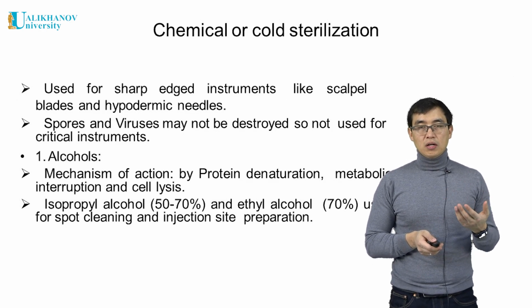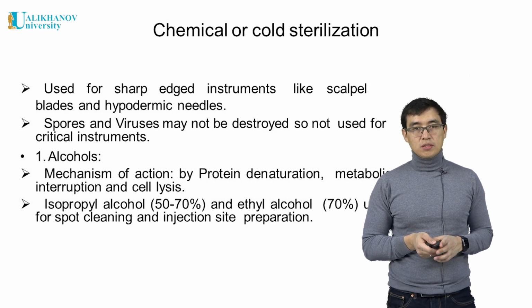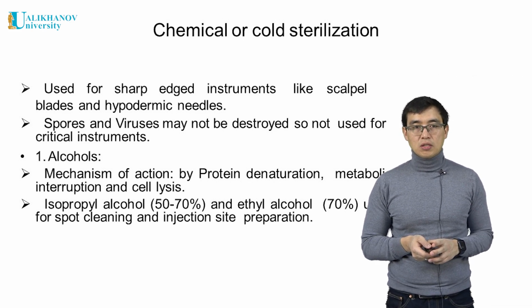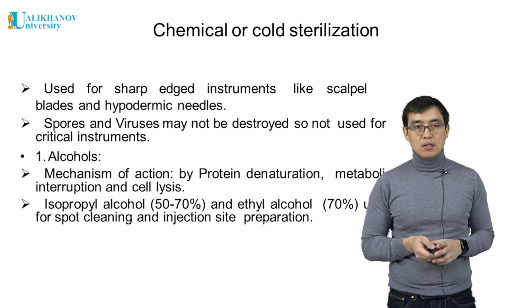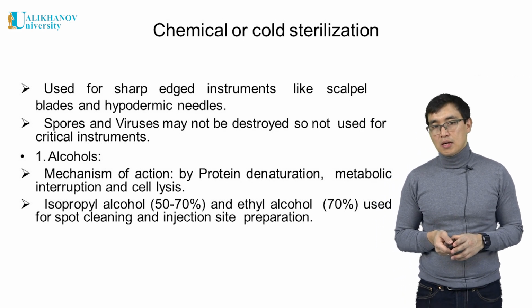Chemical or cold sterilization can be used for sharp-edged instruments like scalpel blades and hypodermic needles. Spores and viruses may not be destroyed, so it is not used for critical instruments.